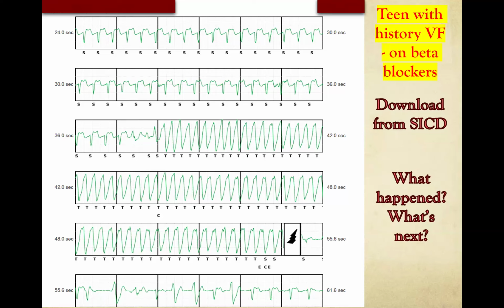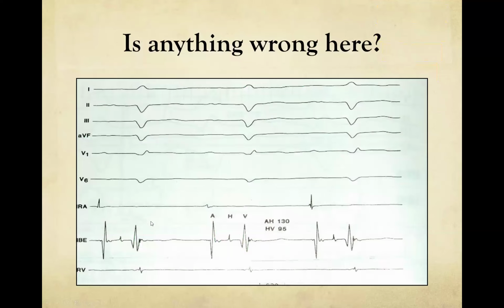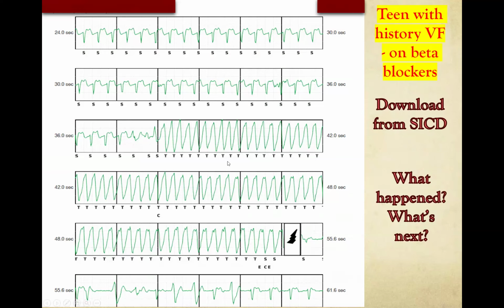And in order to, quote unquote, pass the test, the patient has to have adequate ECG QRS size in 2 of the 3 vectors. In this particular case, I think the patient met all 3 vectors.